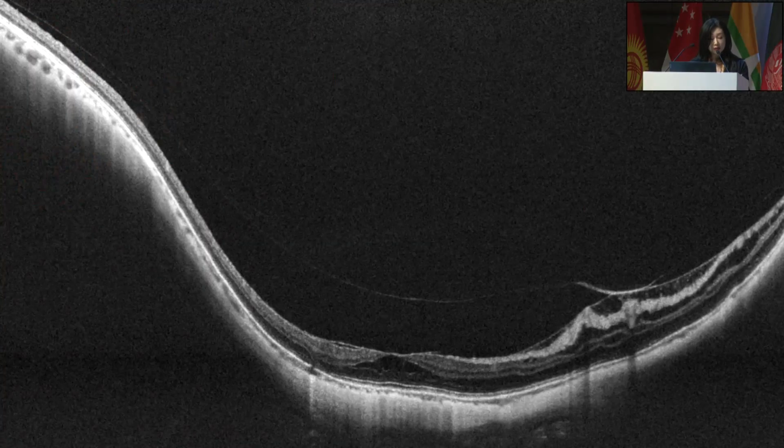But an oblique OCT image reveals three lifted retinal vessels with posterior vitreous adhering to the inner retinal surface at the sites of retinal vessels, and multi-layered schisis surrounds the vessels, and outer schisis extends toward the fovea from these vessels. This vascular traction may be missed in conventional 6 mm scans.